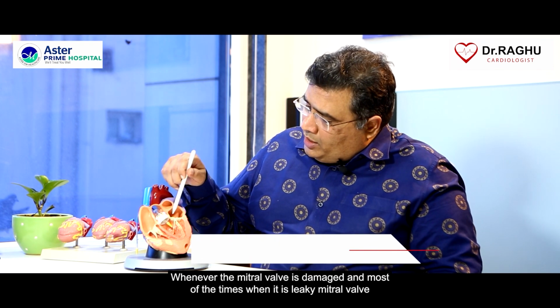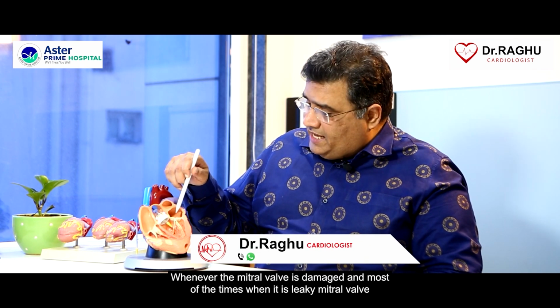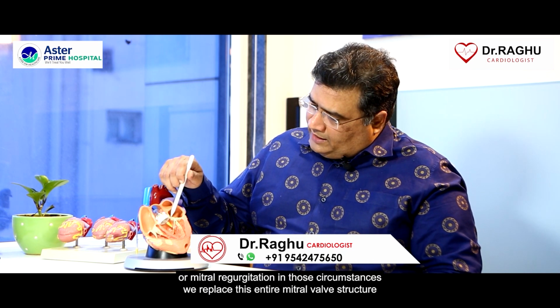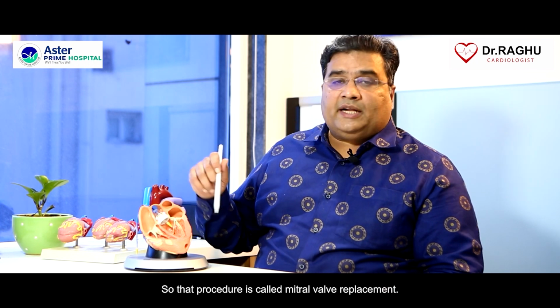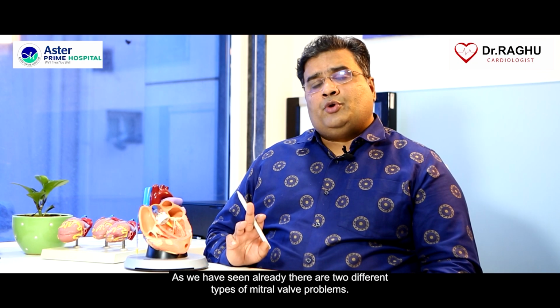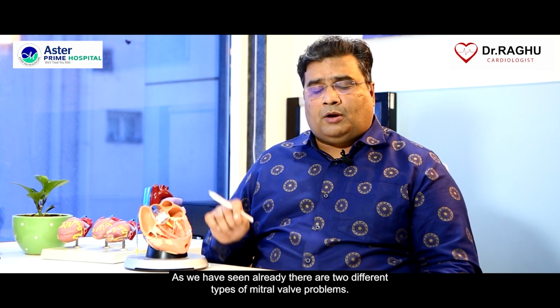Whenever the mitral valve is damaged, and most of the time when it is a leaky mitral valve or mitral regurgitation, in those circumstances we replace this entire mitral valve structure with an artificial valve. So that procedure is called mitral valve replacement.